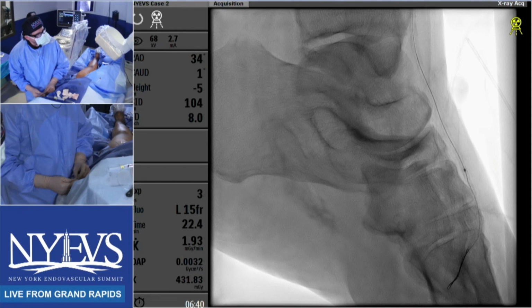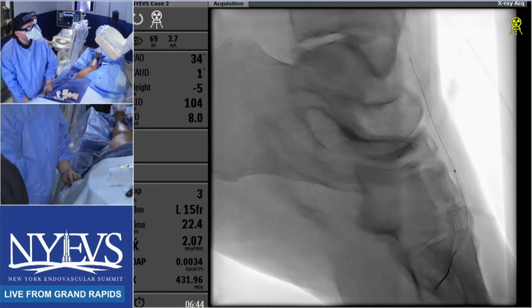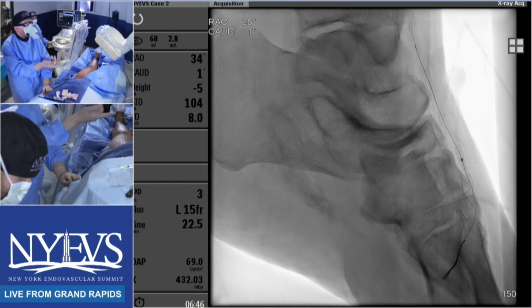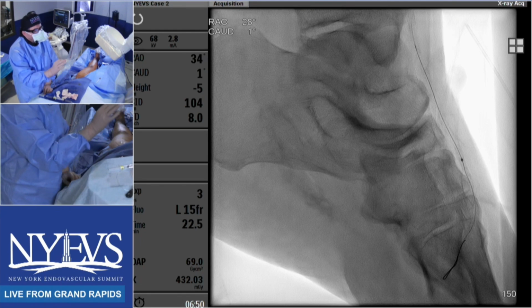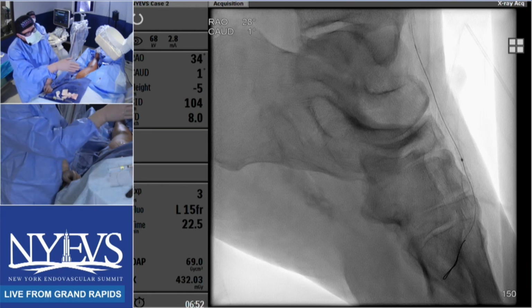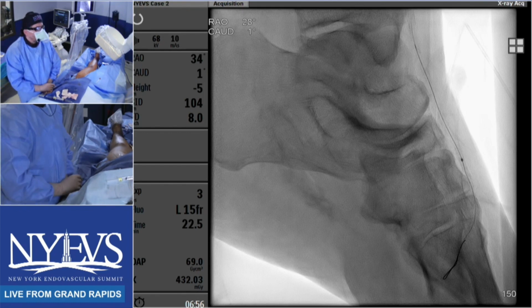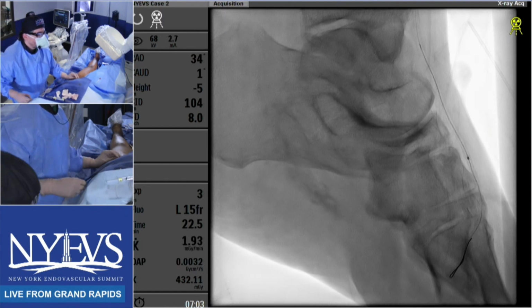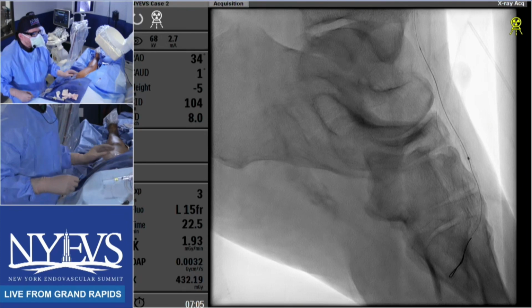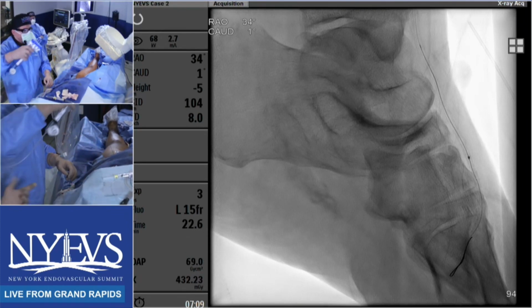Let me have a coronary balloon, guys. So look at that, guys. So I'm getting into the digital branches before I cross into the lateral plantar artery. That shows you how diseased the vessel is. Can you imagine? This is probably the inferior digital branch. 2.0, please. So when that happens and I'm not able to advance a fresh 2.0 balloon, we're gonna take advantage of this right here. We're gonna balloon up to this point.